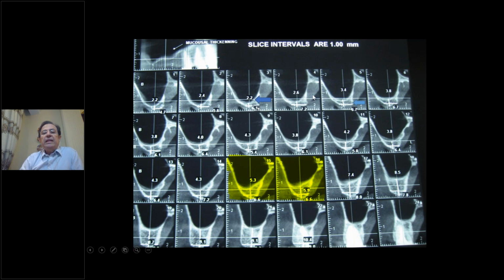But if we have less than 3 millimeters, due to getting primary stability of the implant, it's not recommended. Some expert surgeons do it with a lesser amount of bone, but generally the recommendation is that less than 3 millimeters is better done in two stages: first the maxillary sinus augmentation, and after 4 to 6 months, implant installation.